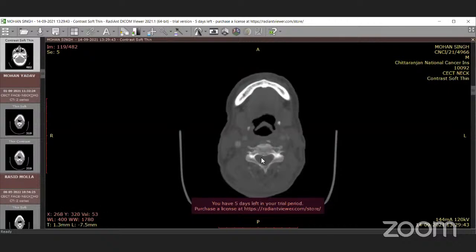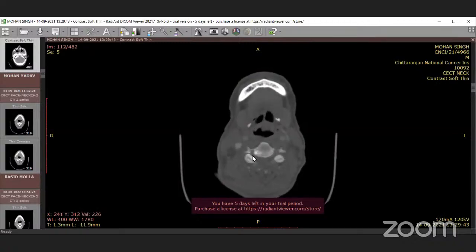This heart-shaped structure in between is the cervical vertebral canal through which the cervical cord goes, and we can see there are some spaces between the articular facets on either side and the body. This is the level of the exit foramina, the neural foramina, through which the consecutive cervical exiting nerve roots emanate.